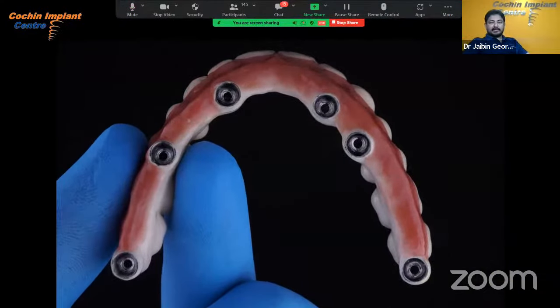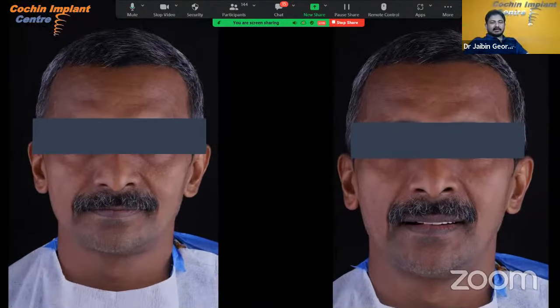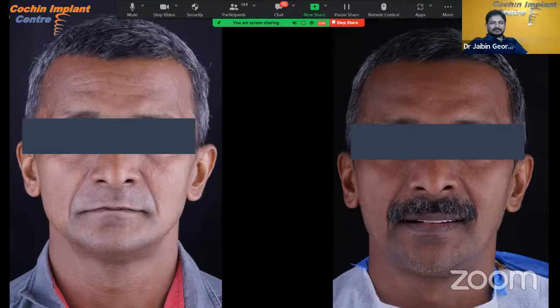And we made a milled titanium framework and a PFM prosthesis. This is the prosthesis. And this is post-op after the final prosthesis, before and after.